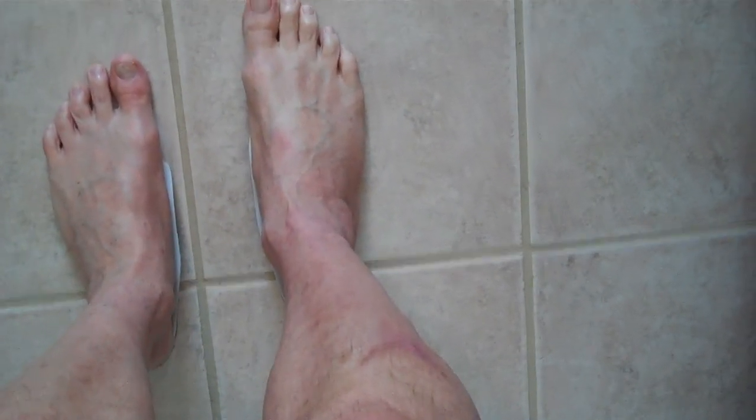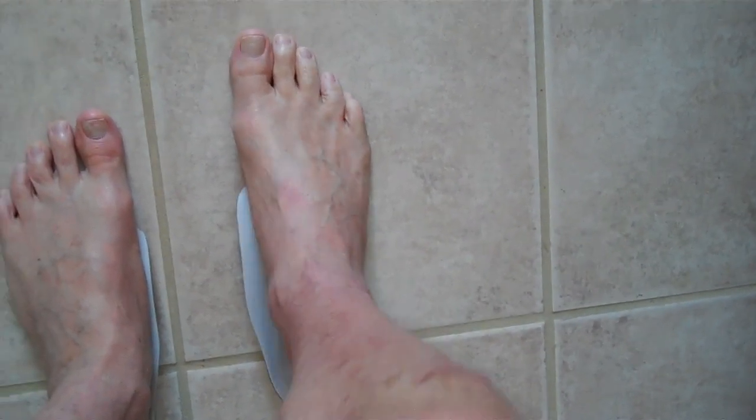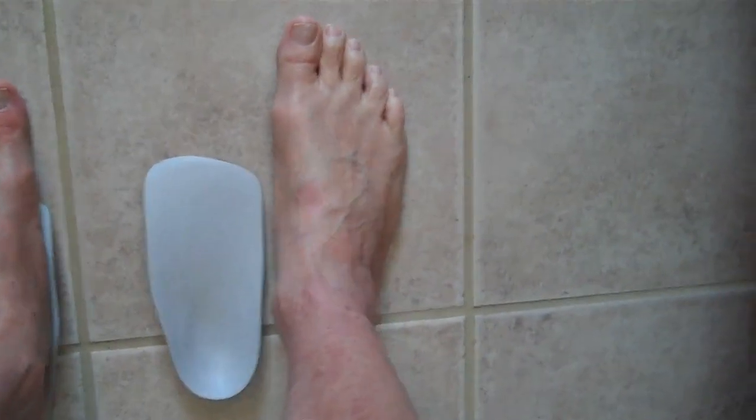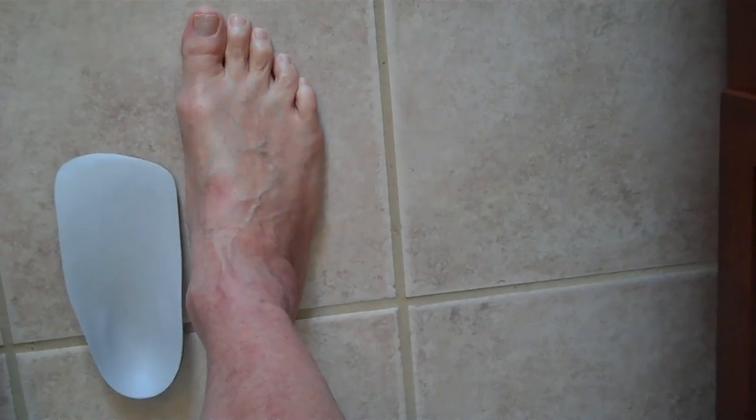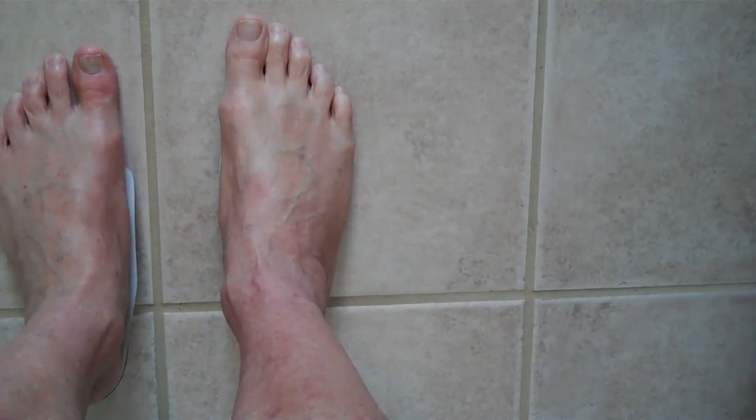Let me show that again. This is with the arch, and this is without the arch. There's a big difference. This will keep my leg in line and prevent injuries.